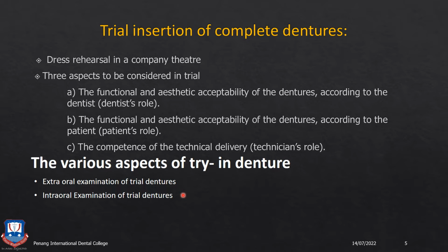Because remember, many of the patients who come to you for denture insertion belong to a profession where they are active speakers. They may be active social activists, they may be an imam of a masjid, or they may be a pastor, or they may be a priest, or they may also be teachers or headmasters and principals. So speech is one of the very important reasons for which many patients come to you to seek the complete denture treatment. So it is very vital that your teeth arrangement or the teeth setup does not impede the patient's pronunciation.